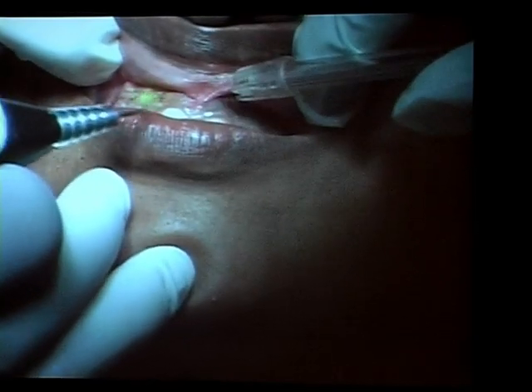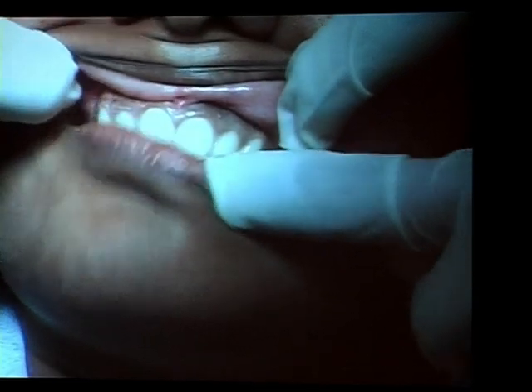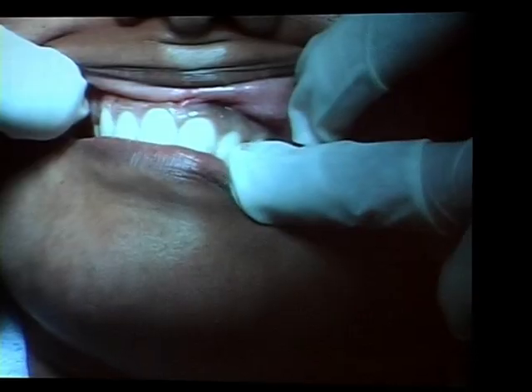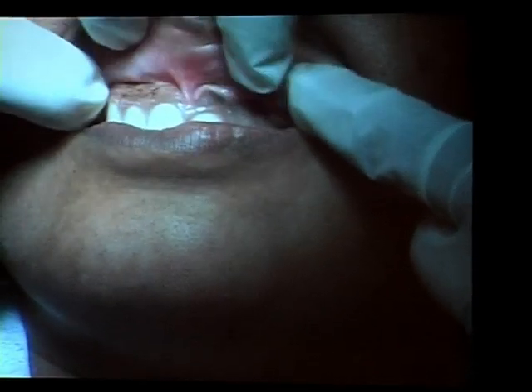I think you'll need to go up to at least 1 watt. It's too low right now, the setting that you're using. Can you set it to 1 watt average power?